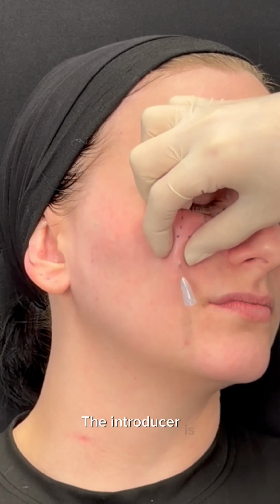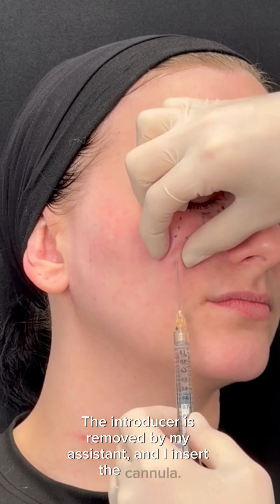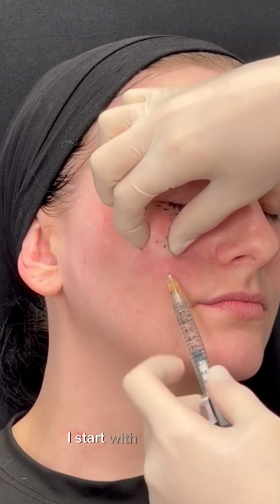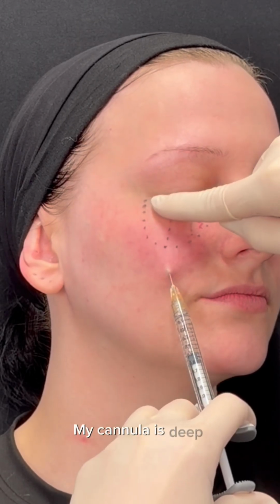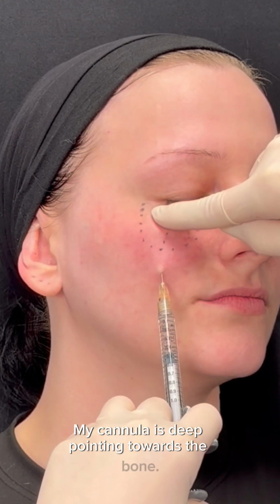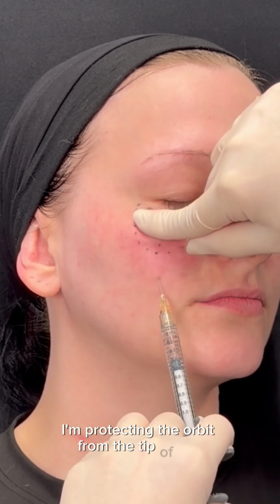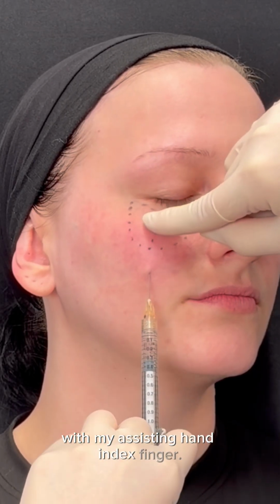The introducer is removed by my assistant and I insert the cannula. I start with the lateral compartment. My cannula is deep, pointing towards the bone. I'm protecting the orbit from the tip of the cannula with my assisting hand index finger.